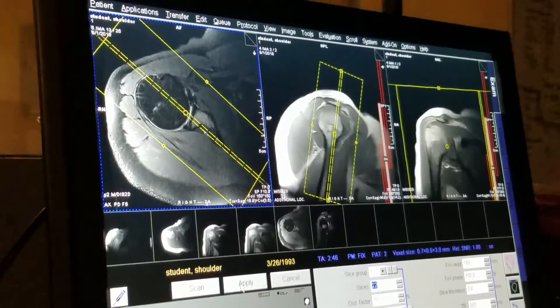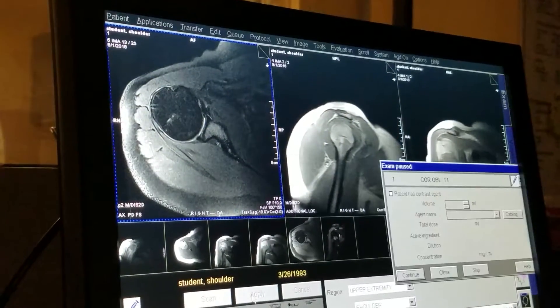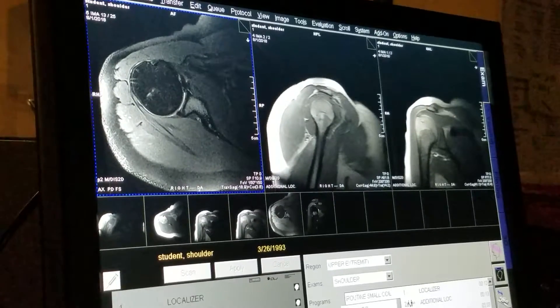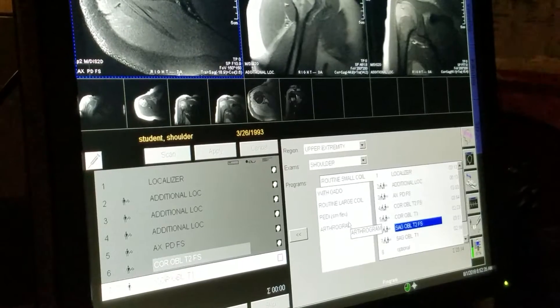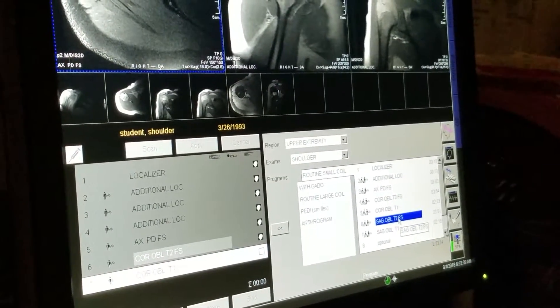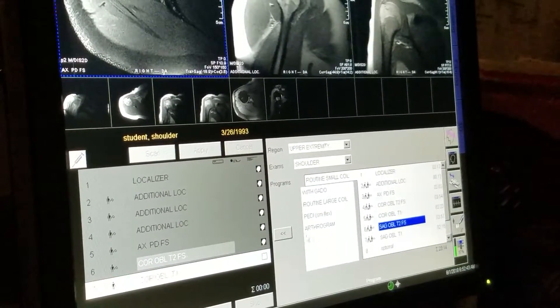And then we'll run that. The next scan is two and a half minutes. While that's running, we'll position for our sagittal obliques. We do two sets of sagittal obliques. The first one is to evaluate the shoulder joint and the rotator cuff, and that's the sagittal oblique T2 fat sat.